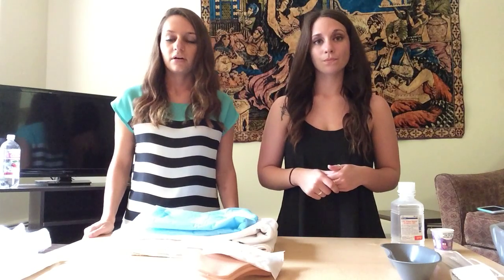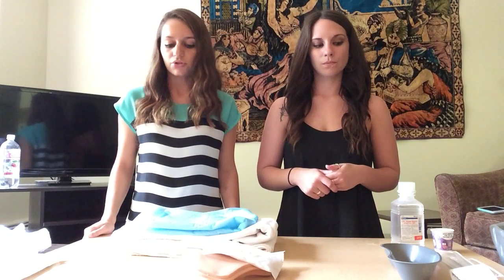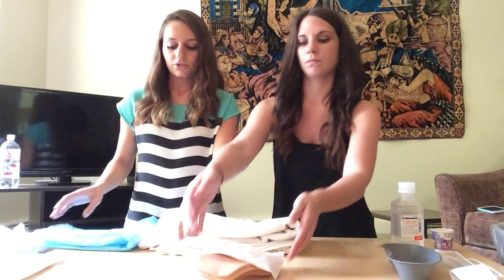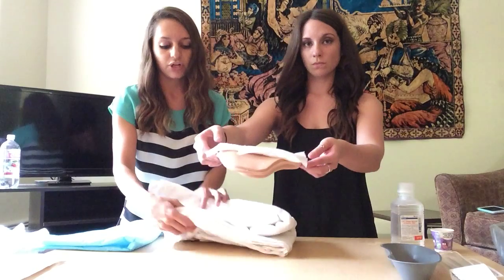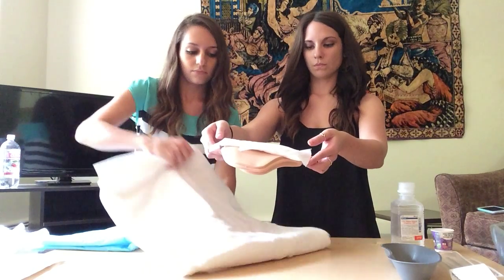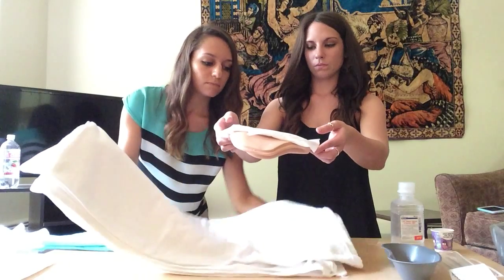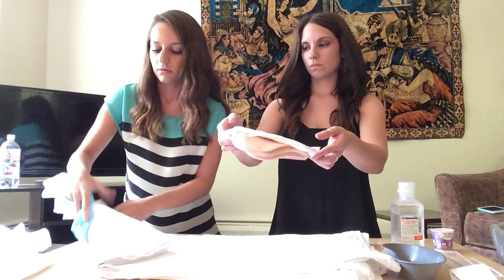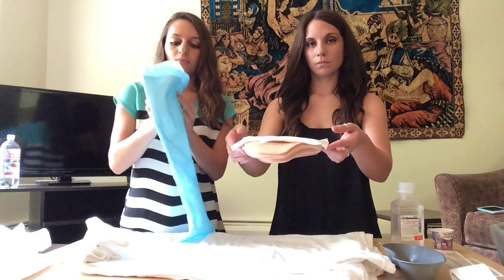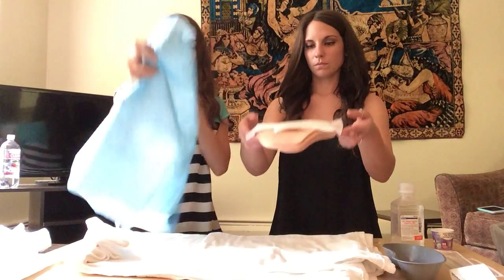Now that our equipment is all set up the way it should be, we are going to place the bath blanket under the patient. This is just to catch any drainage that might not be picked up by the blue pad. And now we'll place the blue pad under the patient as well.